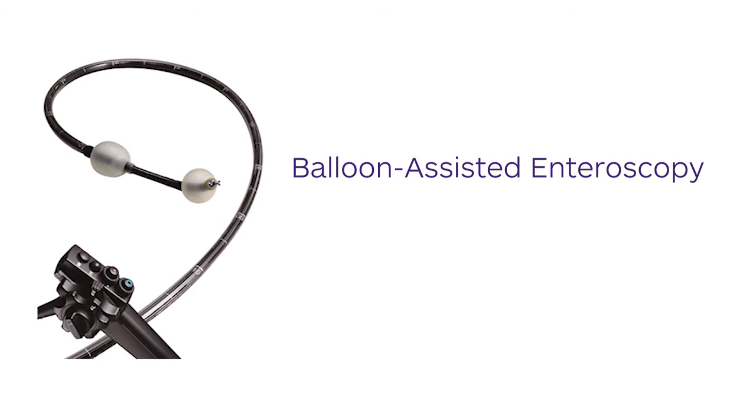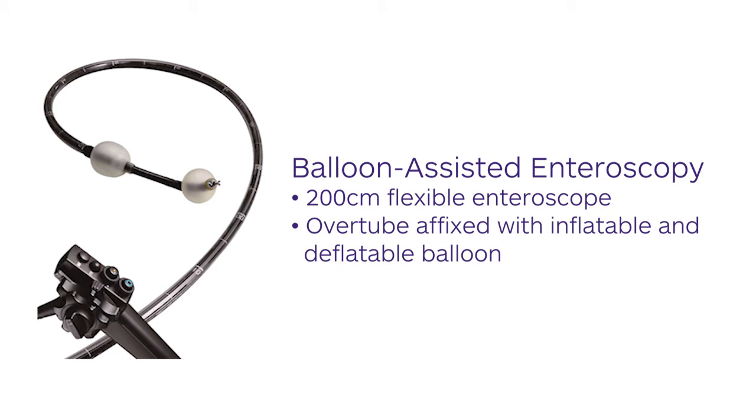Balloon-assisted deep enteroscopy overcomes many of the limitations of other indirect, limited, passive, and risk-laden approaches to a small bowel examination. Balloon-assisted enteroscopy is performed with the use of a 200 centimeter length flexible enteroscope with an overtube affixed with an inflatable and deflatable balloon at the tip.